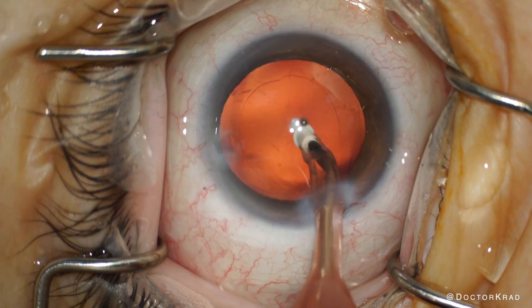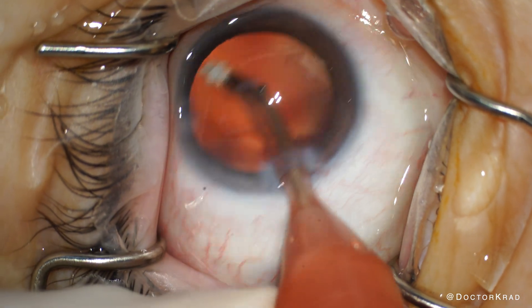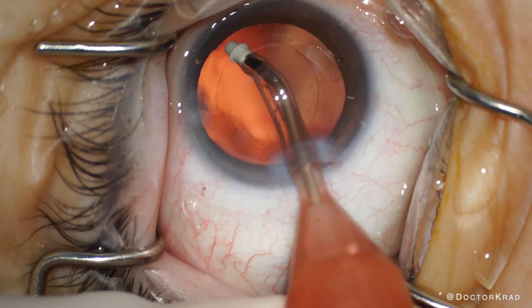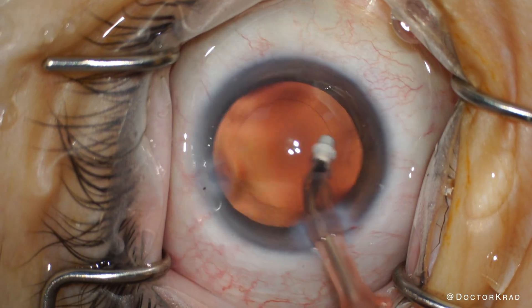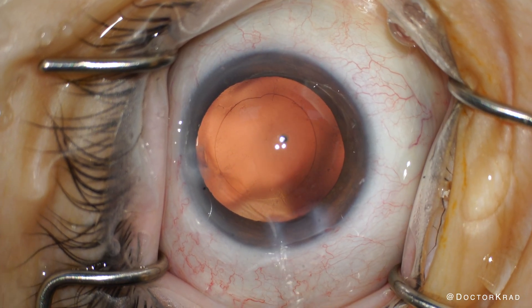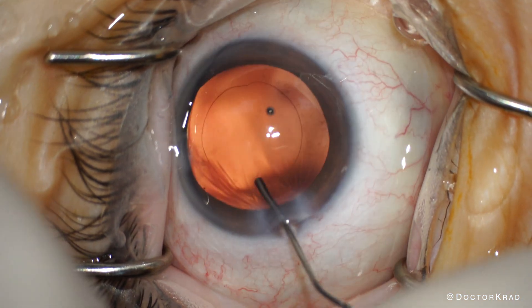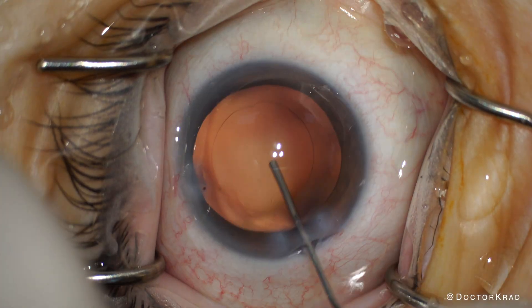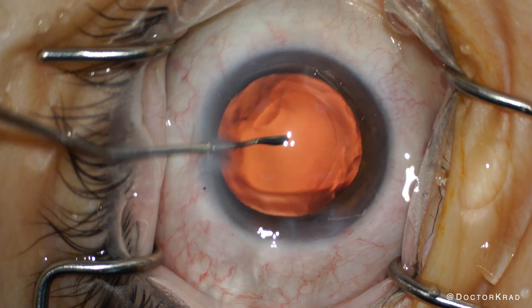That means still polishing the posterior capsule, sweeping the anterior capsule to ensure that it's very clean, and making sure that her basic monofocal lens implant is very well centered. Now if we don't polish the posterior capsule thoroughly or sweep the anterior capsule, will it be noticeable to the patient? Probably not, but it's not adding a cost burden to do so, so I just do it. Next, I'm going to power wash the posterior capsule with BSS — I find that this decreases the chance of needing a YAG capsulotomy in the early postoperative period.